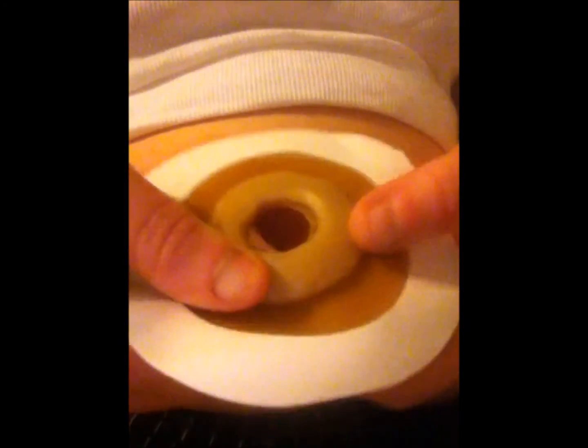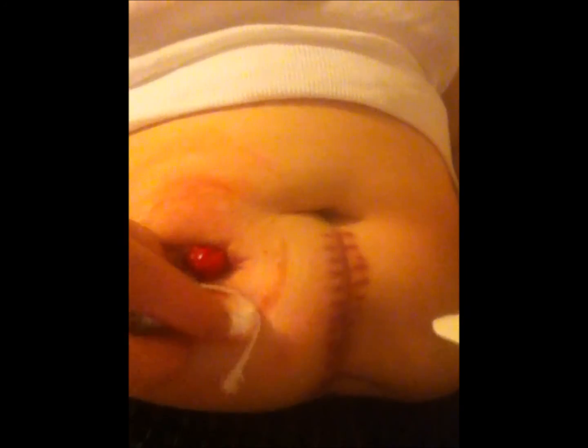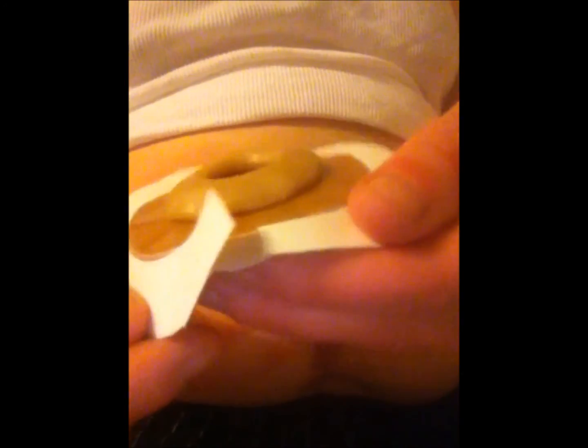I use my fingers and I kind of mold it. It's just kind of like silly putty, and I just kind of mold it to my wafer, and that will make a nice barrier for my ostomy to last me for a few days. This is adhesive, just like a Band-Aid. I like to pull that off first, because it does have a little stick to it.